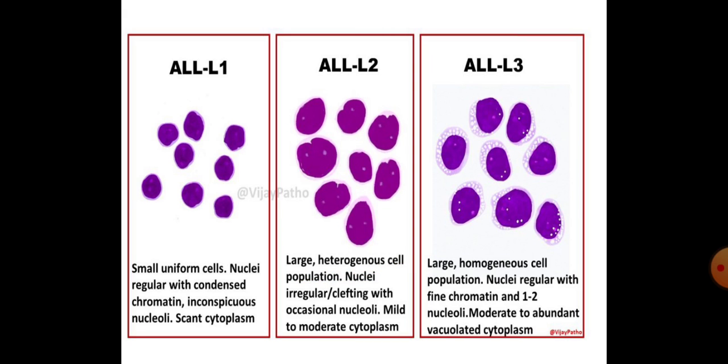So this is the L1 stage, L2 and L3. That finishes the acute leukemias. The next session will be on chronic leukemias.